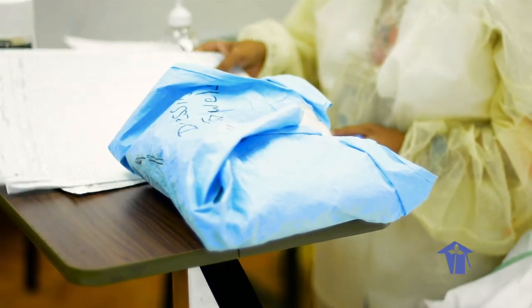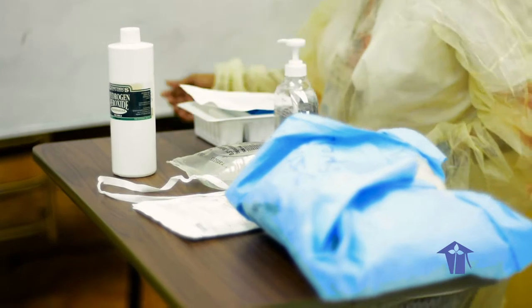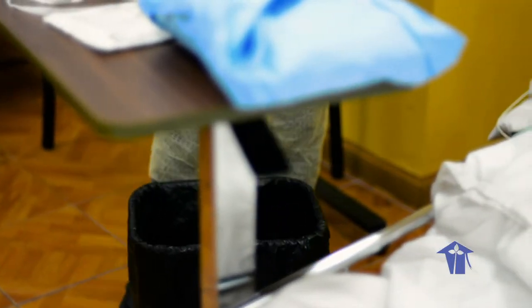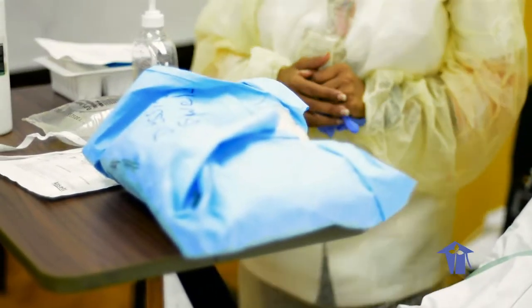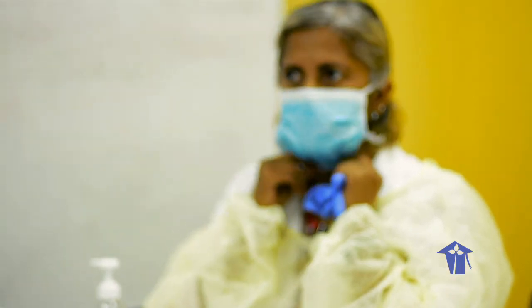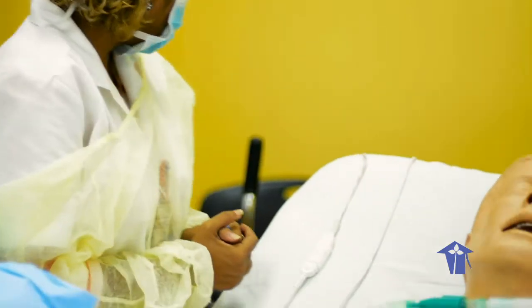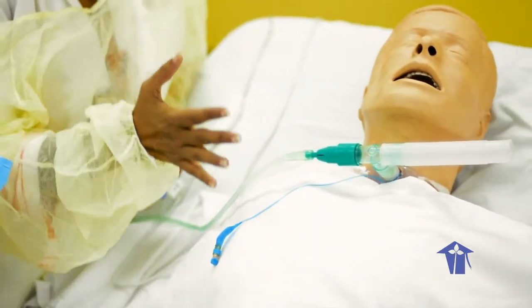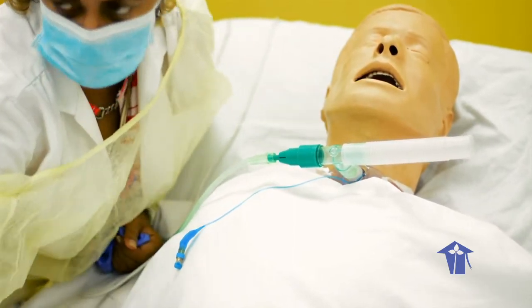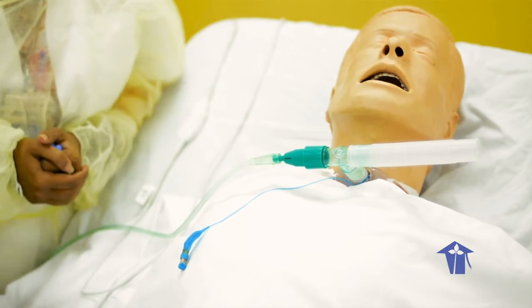Place a trash bin within easy reach of work area. Put on face shield or goggles or mask. Suction tracheostomy if necessary. I'm again looking at your SpO2, your respiratory rate and your capillary refill. I realize that you don't need to be suctioned at present, so we will skip that part.